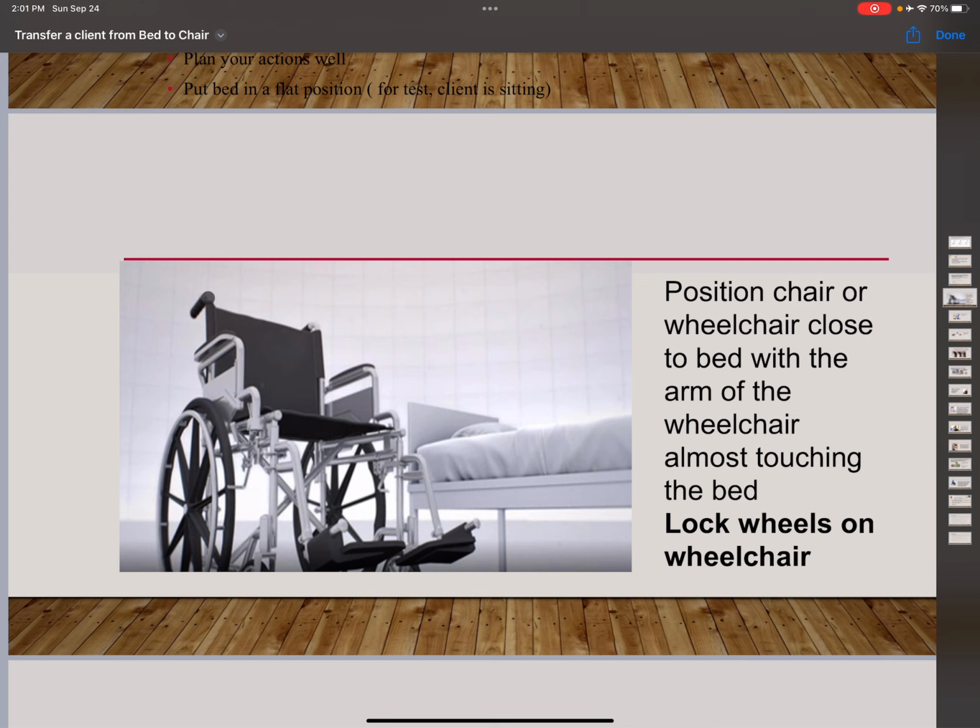We need to incorporate the SWIPE in the skills. So now let's say you introduce yourself. Hi, my name is Mary. Today I'm going to transfer you from the bed to a chair. Is that okay with you? So if that's okay, you go ahead and proceed.